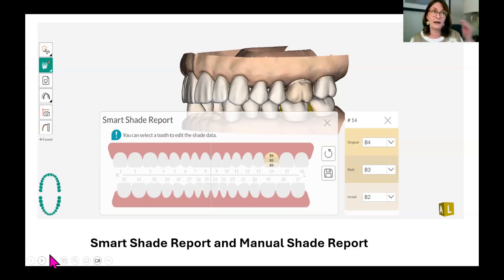Right? Like, back in the day, I remember I was the assistant, and these fuchsia bibs, patient napkins, came out, and they were gorgeous. And so I ordered them, and I'm all excited. And all of a sudden, the shades on our restorations were coming back not right, and we identified it as being this crazy shade of a patient napkin. There's a reason why they're typically baby blue or a cream color. It's because it's more neutral when looking at the patient and selecting that shade.